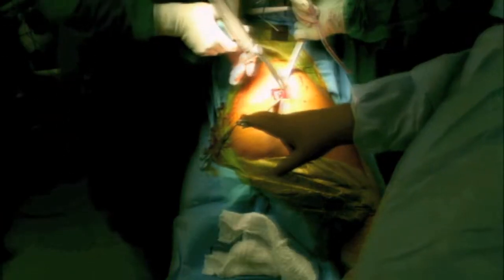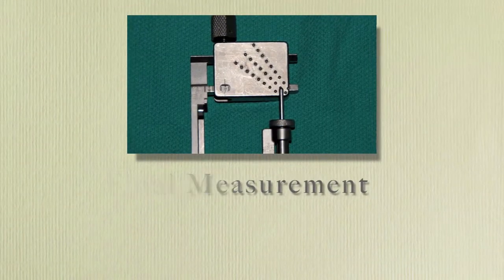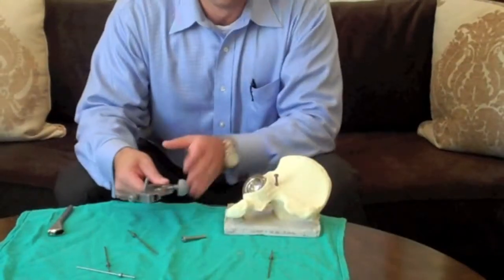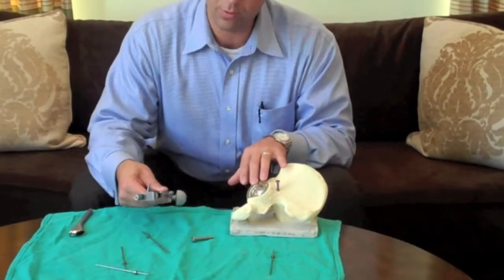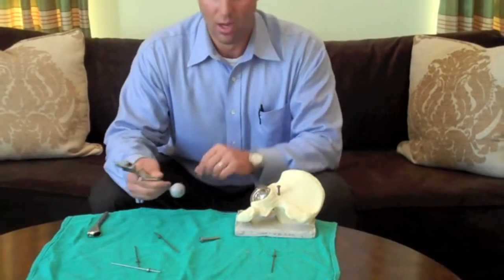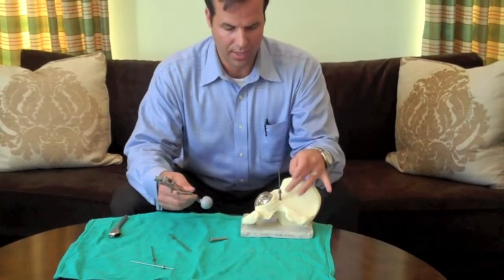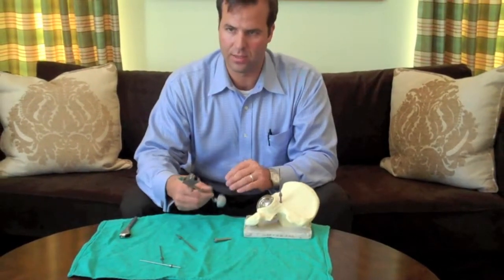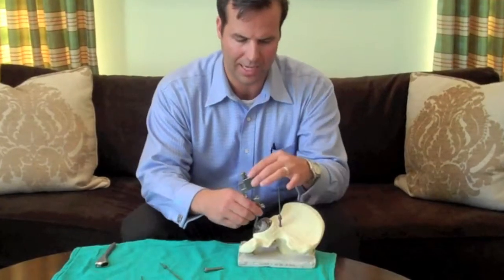The femoral guide can then be removed. The femoral neck can be cut. The femoral head can be taken out of the socket, and the acetabular component can be implanted. This is a 52-millimeter acetabular component that I've implanted into the sawbones, then put in a 32-millimeter liner. I select a 32-millimeter trial head that then snaps onto this acetabular guide. We select the appropriate stylus and slide that into the cannulated screw. There are four styluses, and based on whichever scribe line you stopped on the femoral screwdriver, that tells you which stylus you need to use.